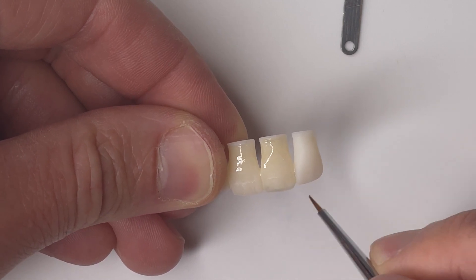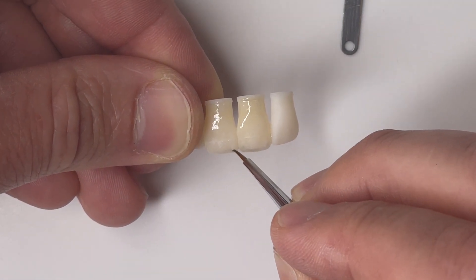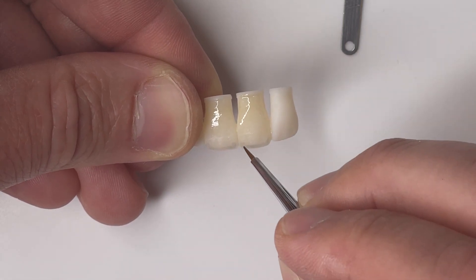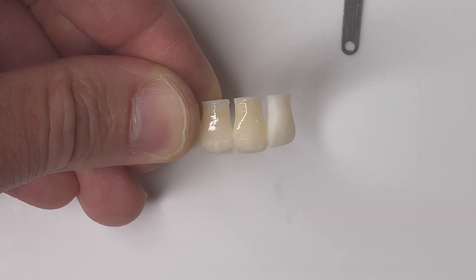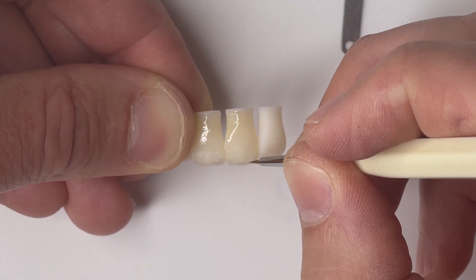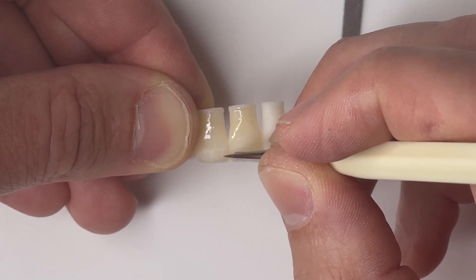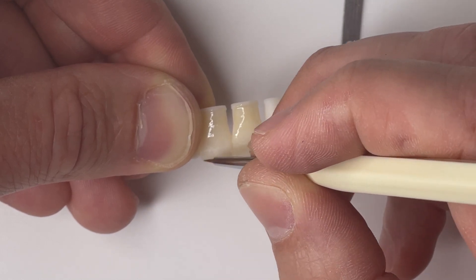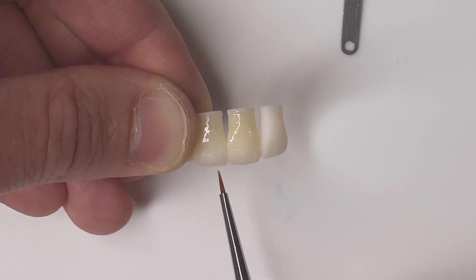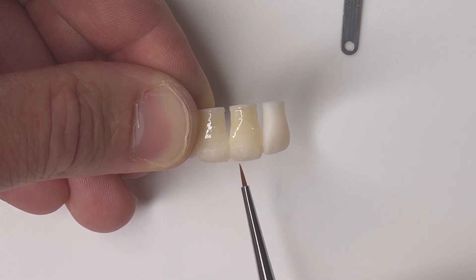Now I'm adding a little bit of gray just below the incisal edge to give a hint of translucency, running it ever so slightly down those line angles away from the incisal edge. Then I'll wipe off my brush and use just a dry brush to manipulate the stain already placed on the tooth. I don't want it to look linear or contrived, so I go back in and spread that gray stain just a little bit to make it more diffuse and more random.